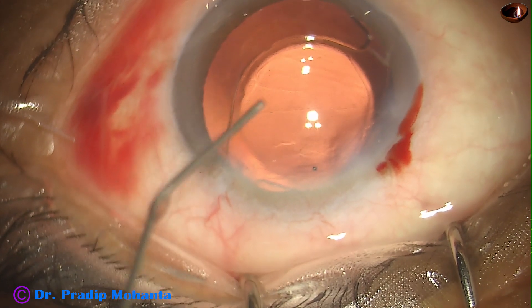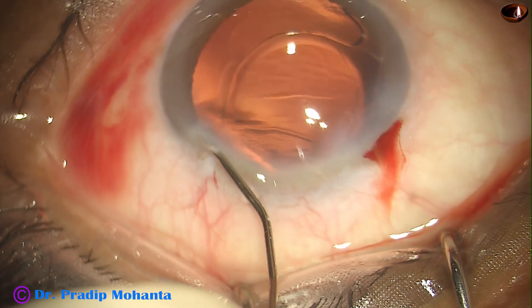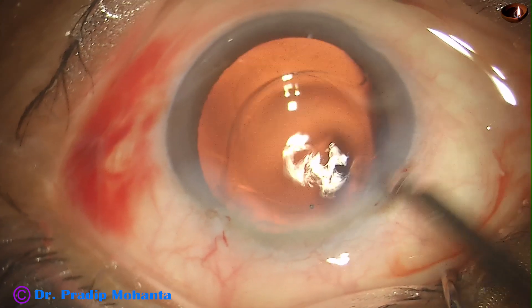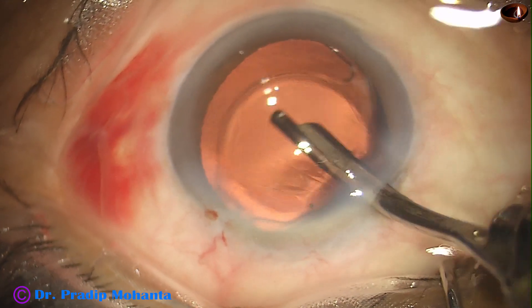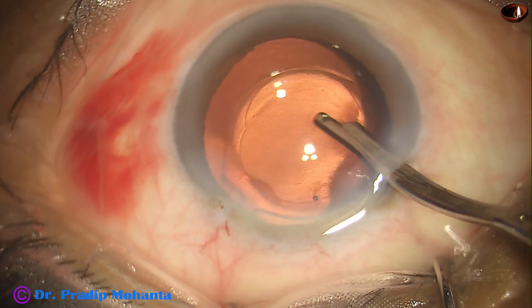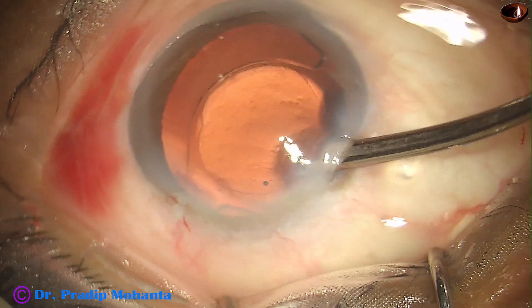Now a bit of moxifloxacin is instilled. The side ports are closed by corneal stromal hydration. When we hydrate, we should inject fluid towards the sclera, not towards the cornea, to prevent DMD — that is, Descemet's membrane detachment. This is the final lavage of the anterior chamber. At this time, any visco that sticks to the corneal endothelium comes out, the anterior chamber is nicely formed, and the case is concluded.